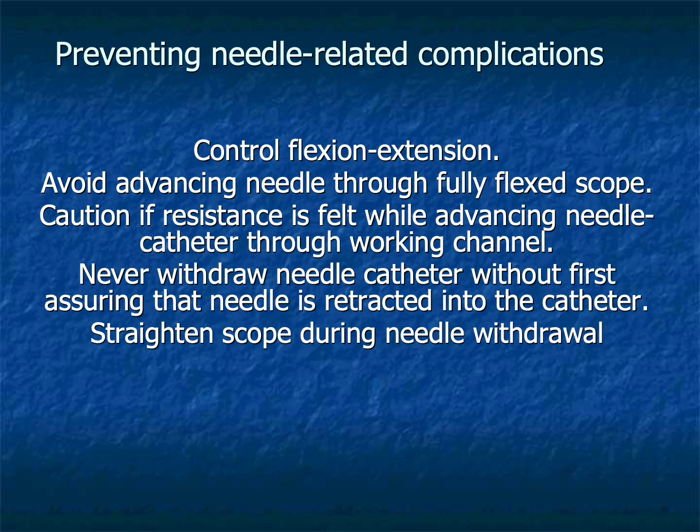The needle should always remain completely retracted within its protective sheath while advancing or withdrawing the catheter through the bronchoscope. If resistance is encountered, the operator should stop immediately and determine the cause rather than applying additional force. Similarly, the bronchoscope should be straightened before withdrawing the needle catheter. These simple habits dramatically reduce equipment damage and prolong the useful life of expensive bronchoscopes.